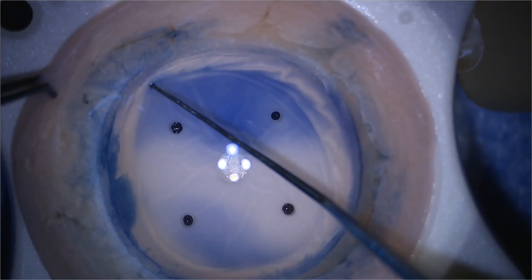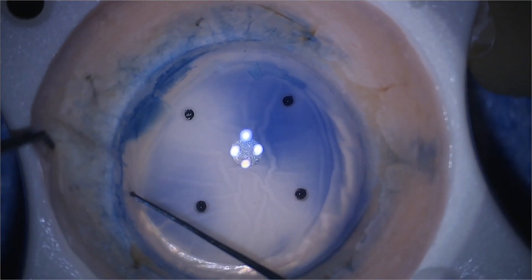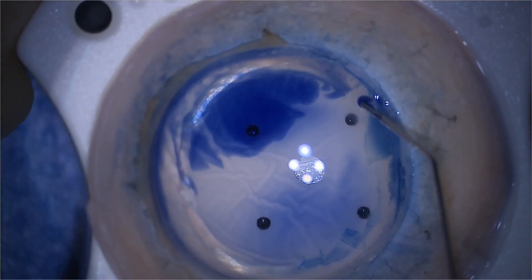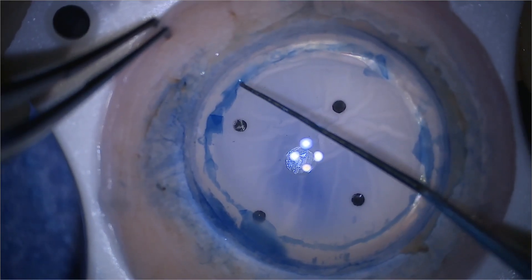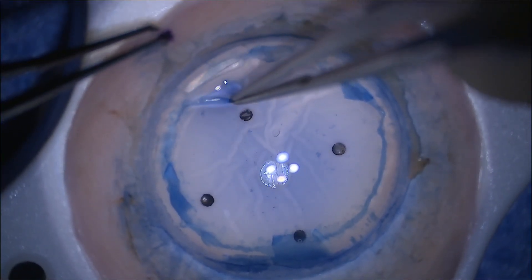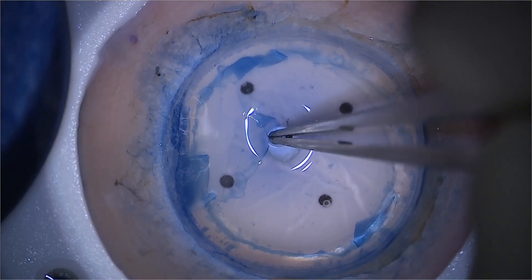This is a very good opportunity to help fellows practice with DMEK preparation. This donor tissue was quite young, so DMEK preparation was quite challenging, but it gives the opportunity for fellows and trainees to utilise the techniques for DMEK preparation. Here I do the standard DMEK preparation but with Vision Blue rather than Membrane Blue. I'm getting the fellow to practice using the Sinski to lift the edges up and then try to peel back — even though we're not using specific DMEK forceps here, as tying forceps often aren't controlled enough and often create little tears, as they're doing here. The fellow is very carefully trying to remove the Descemet's membrane and successfully removing it completely.